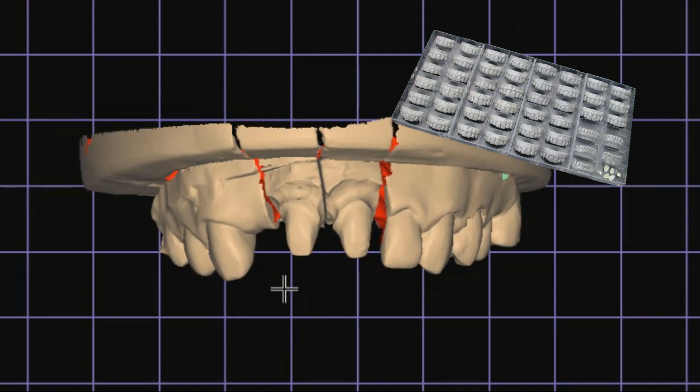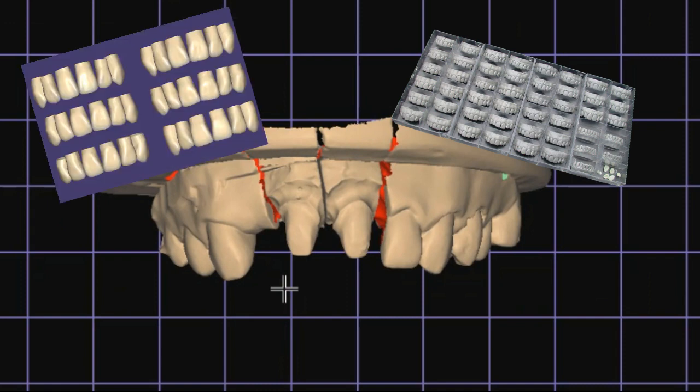There are various fully anatomical libraries present in Exocad that you can choose in the CAD software, so continue watching this video.